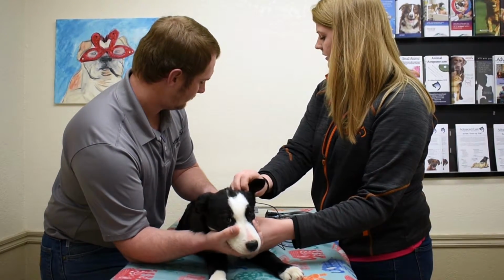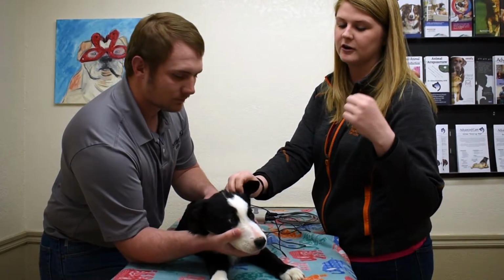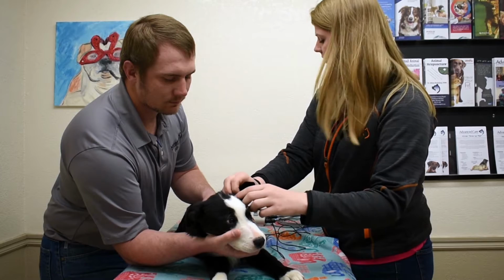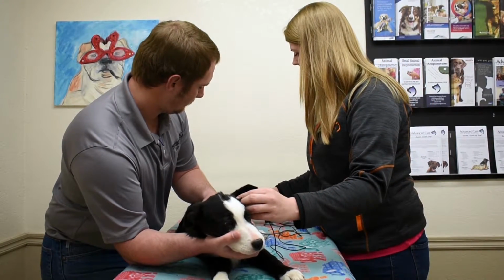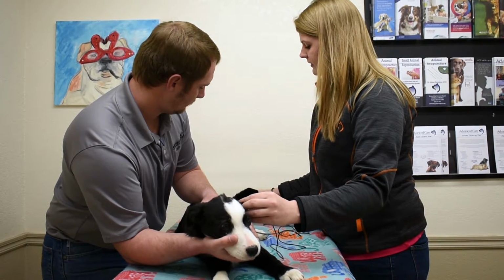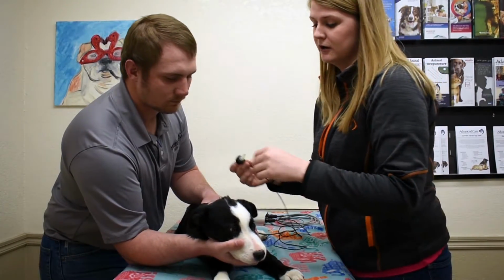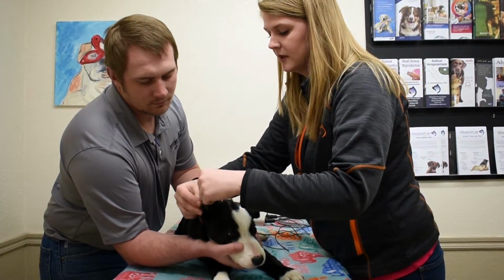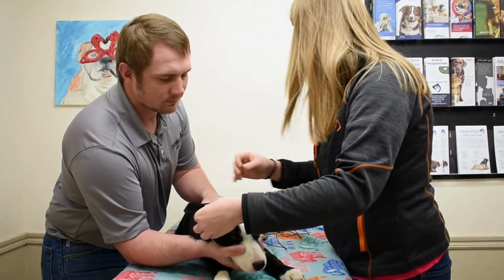So usually we collect a period of waves, so each time this new click sound starts, it'll record data over and over and over. It kind of overlays that, and then we're able to save that. And then that's what we use to submit for hearing testing paperwork. If you guys need OFA submission for hearing testing, that's basically how we do it. So that's the left side. So we're going to do the same thing on the right side.